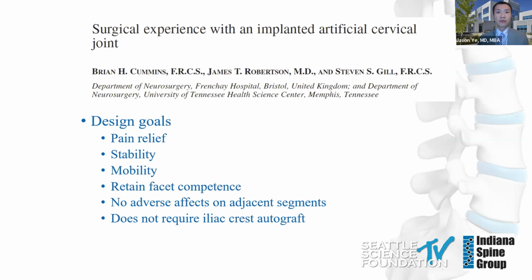Interest in cervical arthroplasty reignited in the 1980s. Dr. Brian Cummins articulated the goals of an ideal arthroplasty device as one that leads to pain relief, has stability, has mobility, retains facet competence, has no adverse effects on the adjacent segments, and does not require iliac crest autograft.